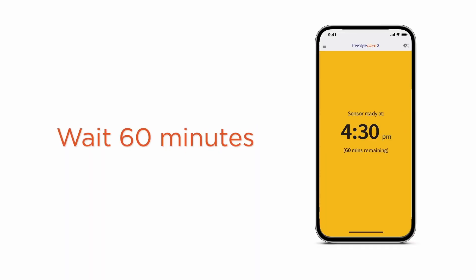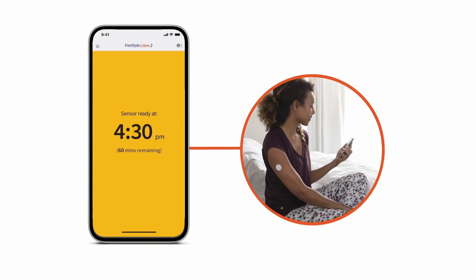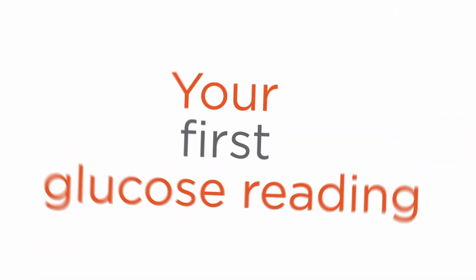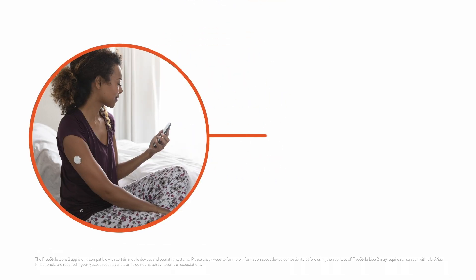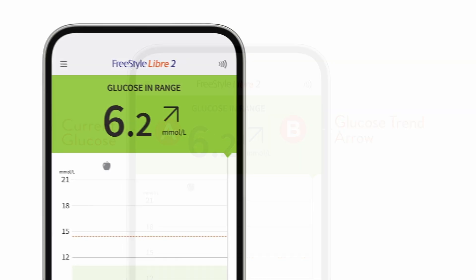There will be a countdown on your screen. Once the countdown is complete, you can scan or view to see your first glucose reading. Bring the phone or reader to your sensor to scan or view directly on your smartphone. On your first scan or view, you'll see your current glucose number and a trend arrow.